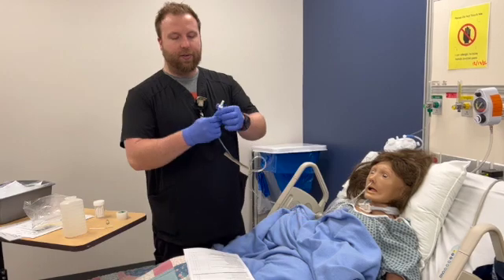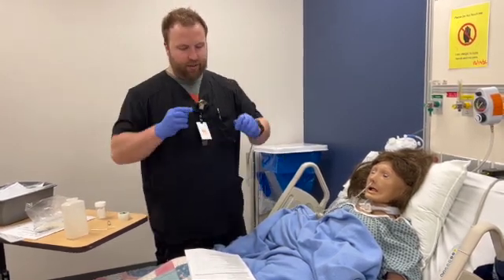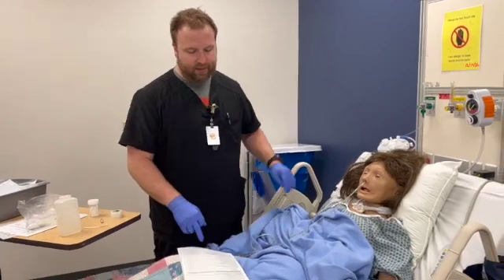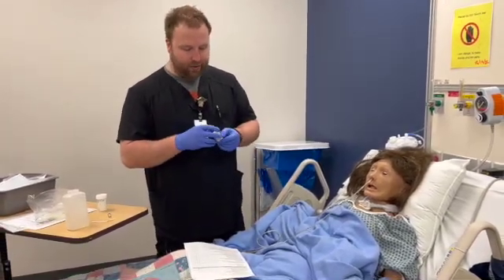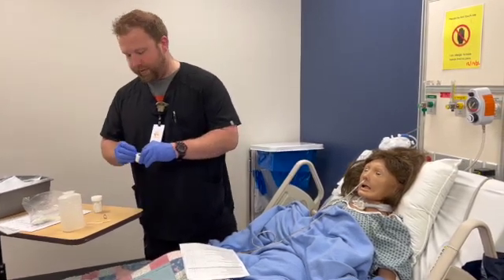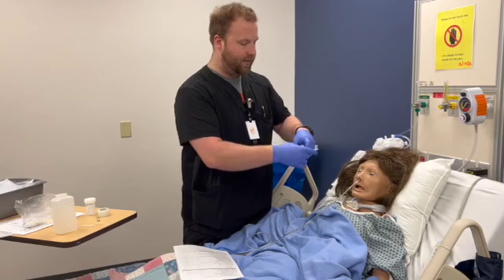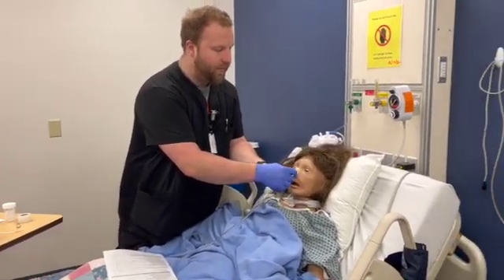You'll want to put on your Salem sump valve, which will be disconnected. Just put it on blue to blue, and then you can put this side in to make sure that the tube doesn't leak. We will fasten this to the patient's nose. Some hospitals and some kits will have a little strip. You can take a piece of tape and put it on the nose and just wrap it around.